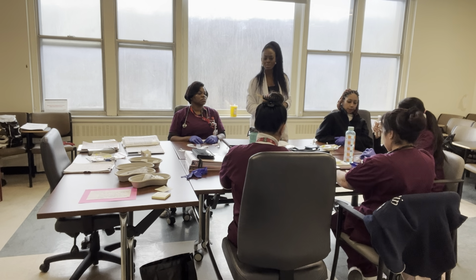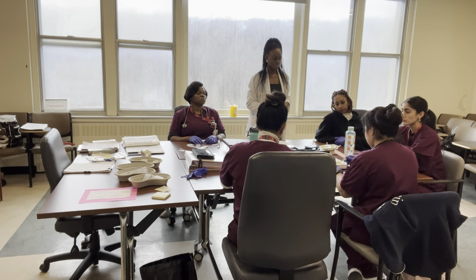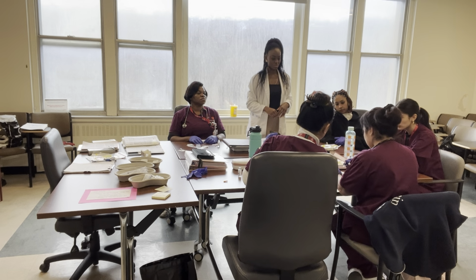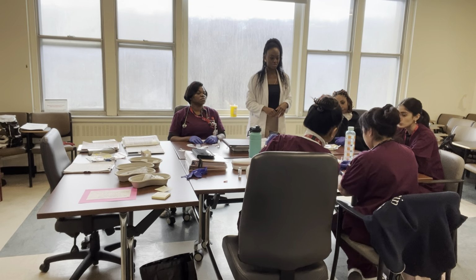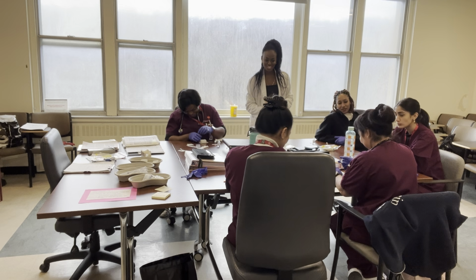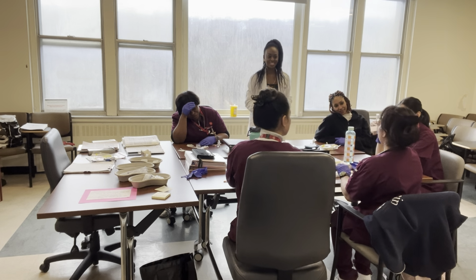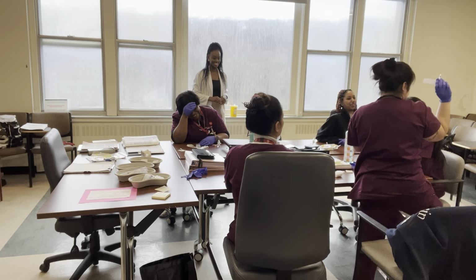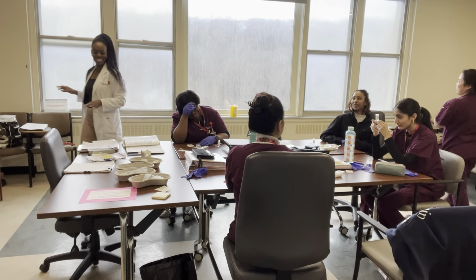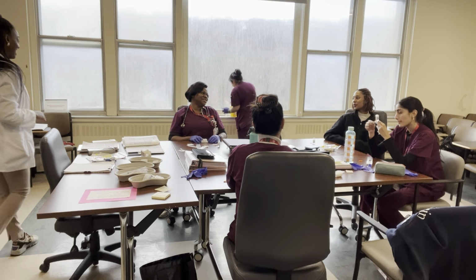We don't have to tell them it's gonna hurt a bit. Maybe it's not gonna hurt. Just tell them you're gonna go in. Sorry, you inject. You haven't even injected it. Gotta inject. She's so funny. She just put the needle in, so it's counting. I'm like, oh, what are we counting? You got a needle. Good job. Okay, I'll take care of it.